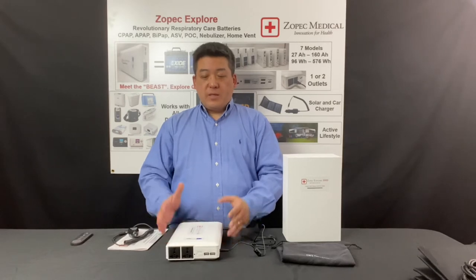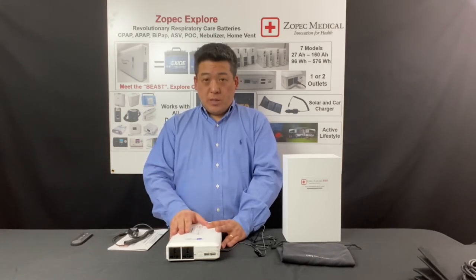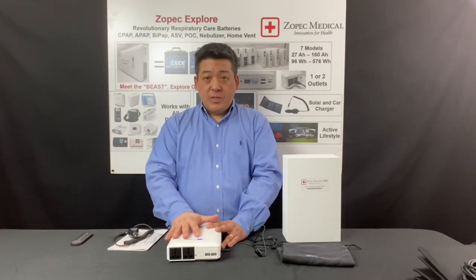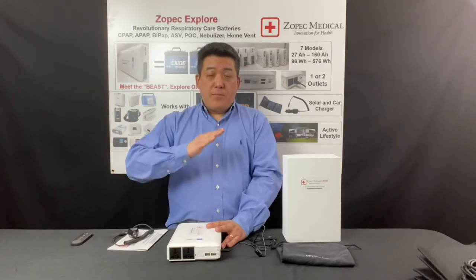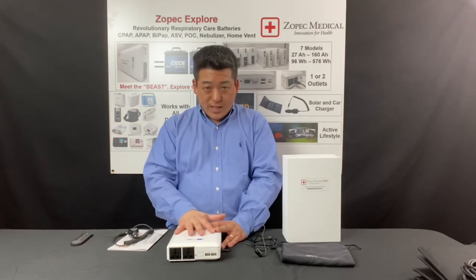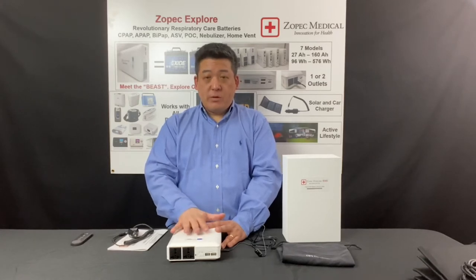Depending on the capacity when you receive your battery, the Zopac Explore 8000 can take up to about 8 hours to charge from full depletion. We recommend that you just charge overnight and not look at the capacity counter, because it doesn't charge linearly. At the initial charge, it might be stuck at a certain number for many hours, and that's normal — the battery is calibrating itself with the capacity counter.